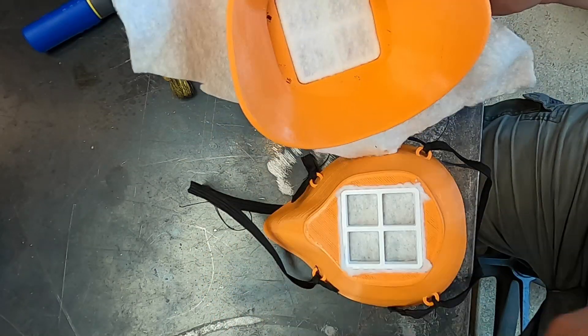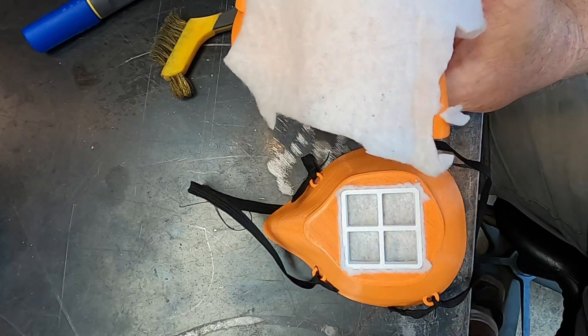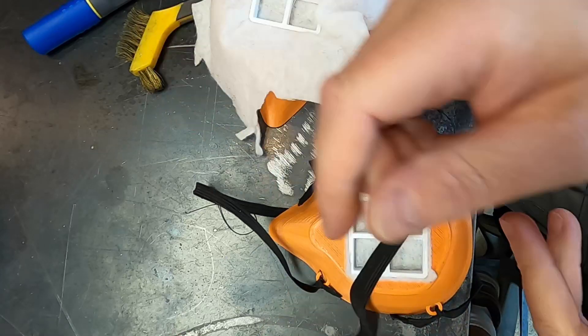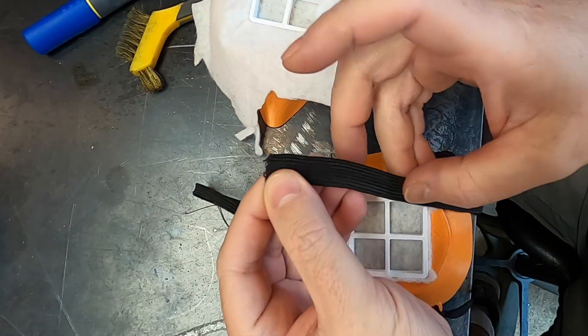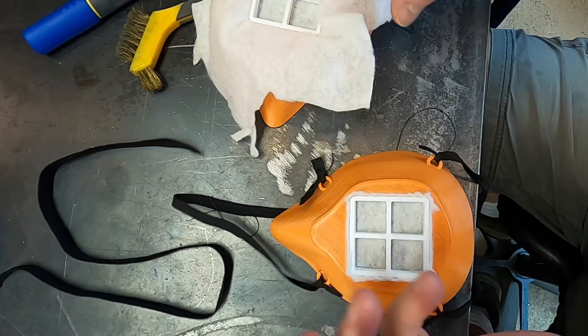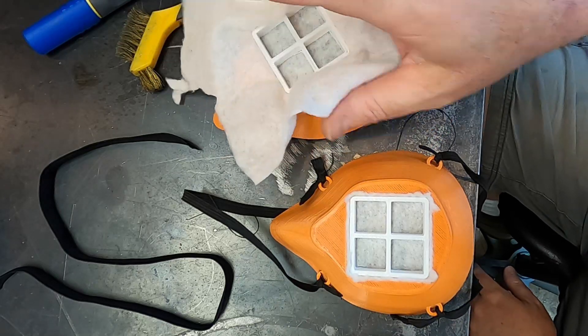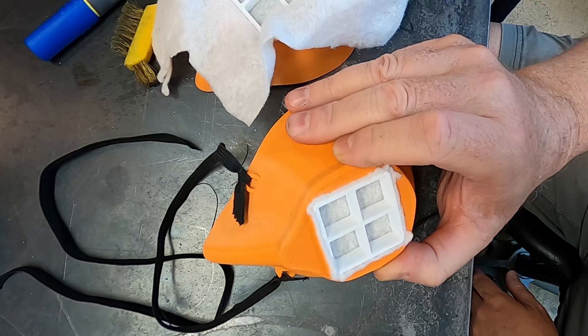And there you go — it sits in there nice and firmly and works fine. Then I just use some elastic. A quarter-inch elastic would be perfect — I had to cut this in half. And then you've got a mask.